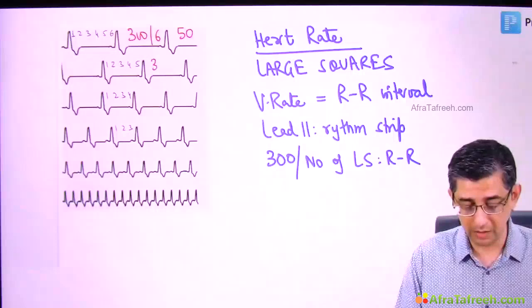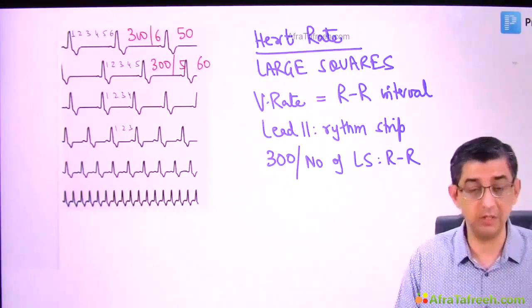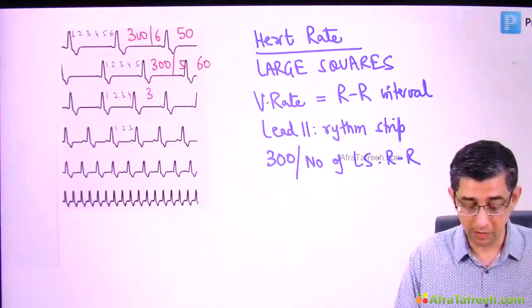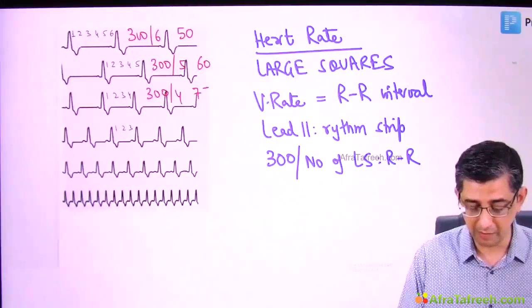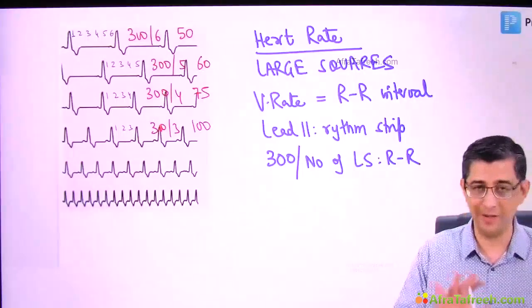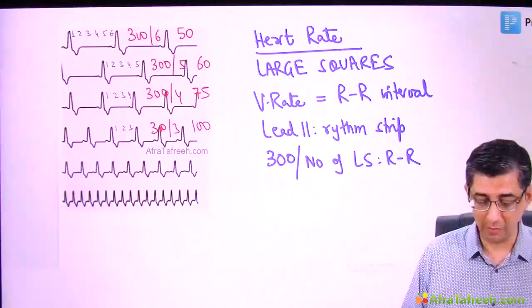In the next ECG that I've highlighted before you, the heart rate is coming down to the lower limit of physiology, maybe a hypothyroidism patient hitting 60. But this is going to be the value for you and me. That is approximately, I'll put it at 75. And now we're going towards the tachycardia range. I'm not teaching you any kind of mathematics. I just want you to be very comfortable with these values.